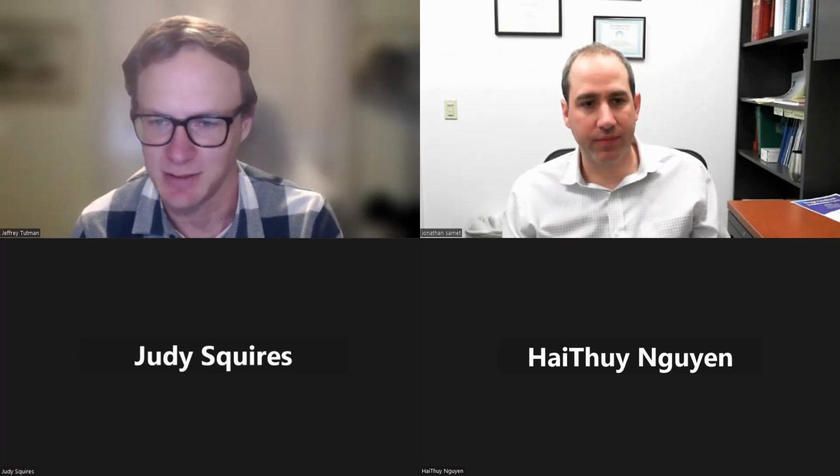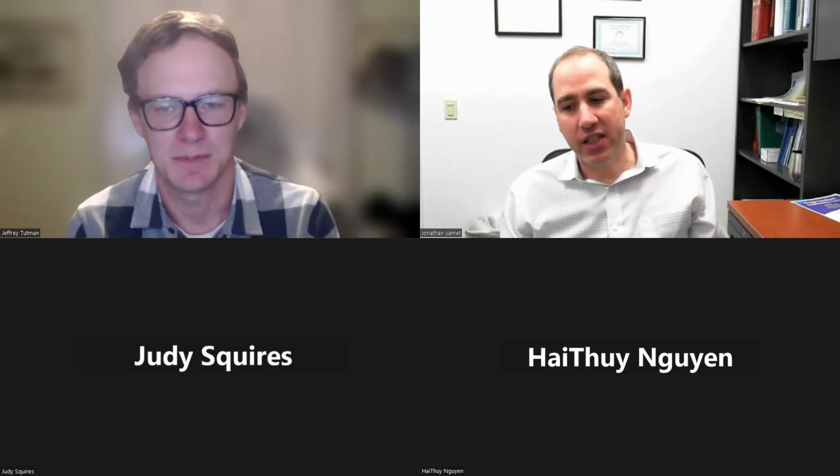Yeah, I'm just thinking, we have 6 MSK radiologists. We have 4 different campuses, really 5, where ultrasounds are being done. Only 4 of them have a radiologist on site on any given day. So I feel like there's a lot of moving parts, but the advice you have is very practical. I think it makes a lot of sense to start where the radiologist is on site, because then you come in the room, the sonographer feels more confident. And you know so much MSK from reading MR, right?